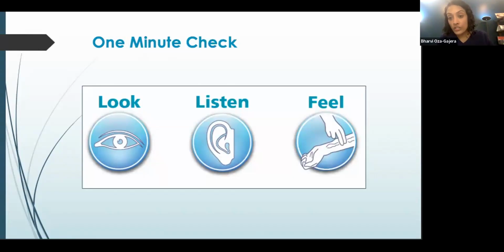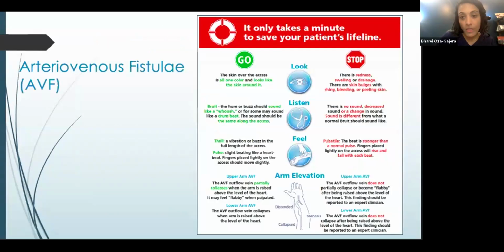And it's basically a look, listen, and feel approach. So essentially, you're doing an inspection, you're auscultating, and you're doing a palpative exam, but it's easy to remember as a look, listen, and feel. And again, it takes less than a minute, and it has been proven to be effective when done every single treatment. And I highlight that it has to be done every single treatment to be effective. So I'll go through the 1-minute check for each of the various dialysis access types.